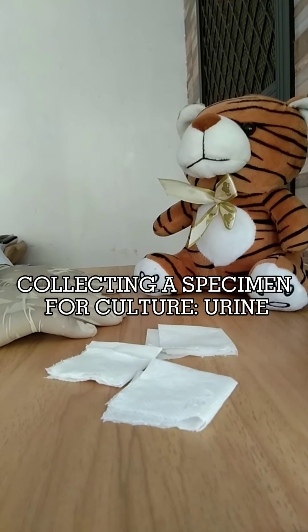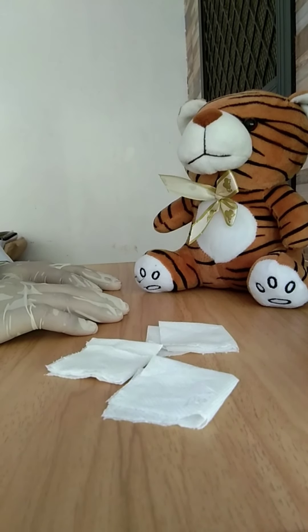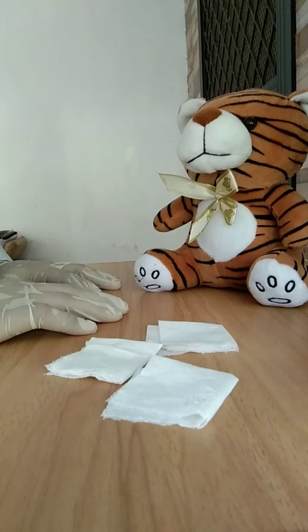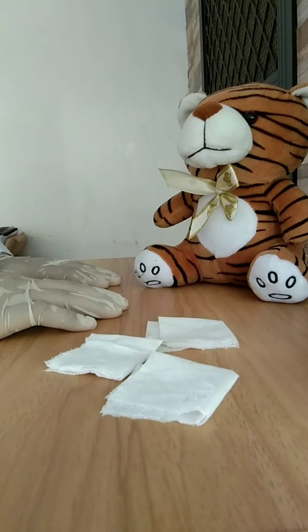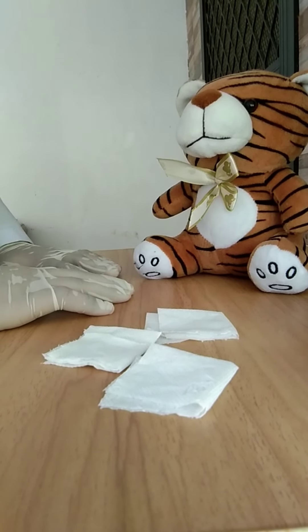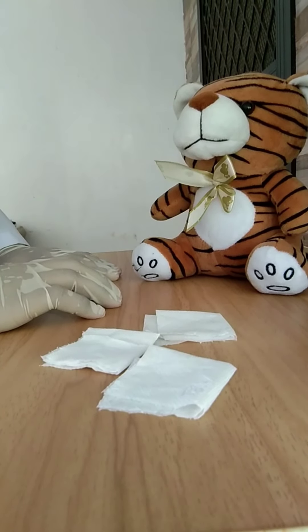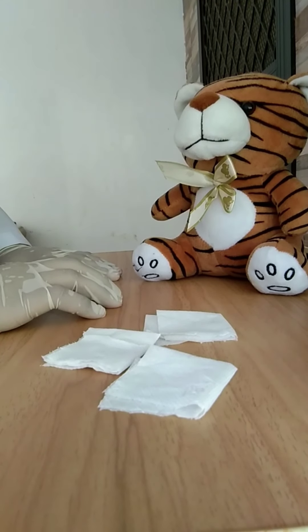Collecting a specimen for urine culture. First, instruct the client to carefully clean his or her perineal area. This reduces the number of microorganisms at the urinary meatus which could contaminate the specimen. For a male client, retract the foreskin slightly if uncircumcised. Tell him to use a circular motion to clean the urinary meatus and the distal portion of the penis, cleaning several inches down and using each towelette only once.